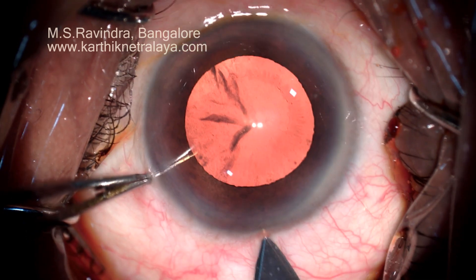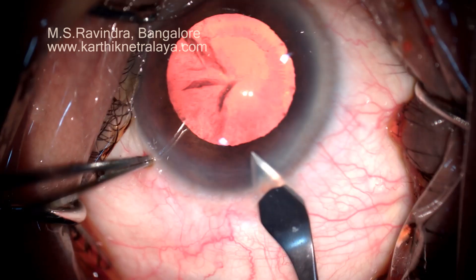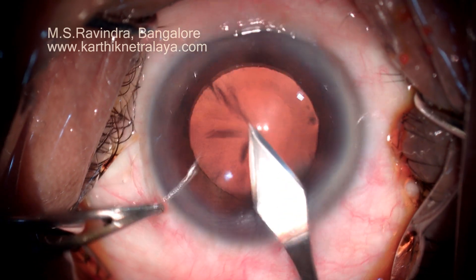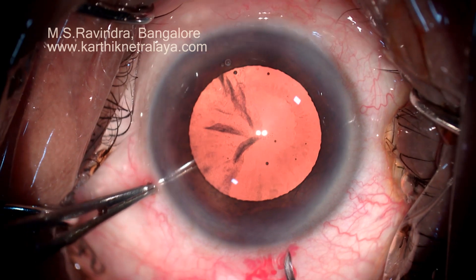The keratome enters through the anterior sclera, transconjunctivally, limbally and through the peripheral cornea into the anterior chamber. Make sure that the exit and entry of the tunnel are parallel to each other.